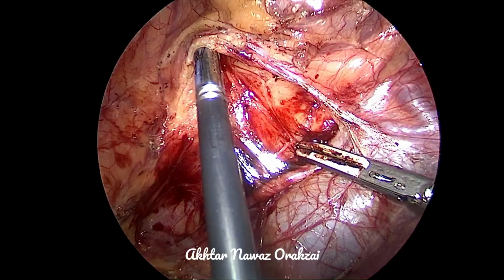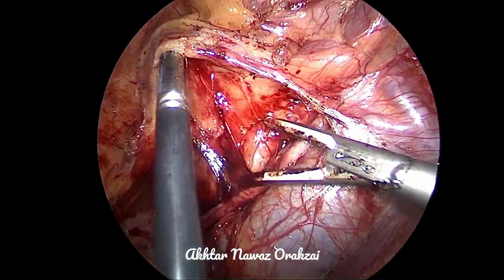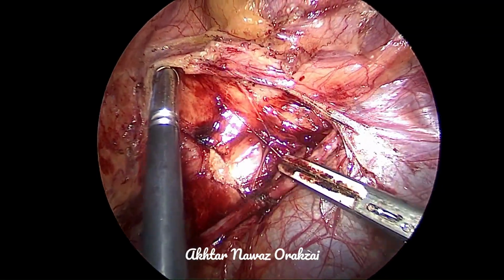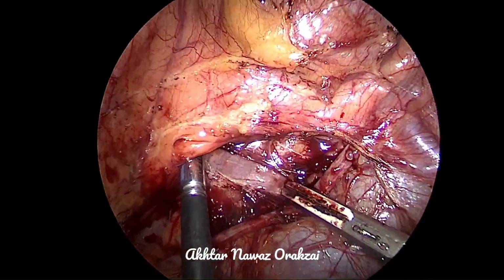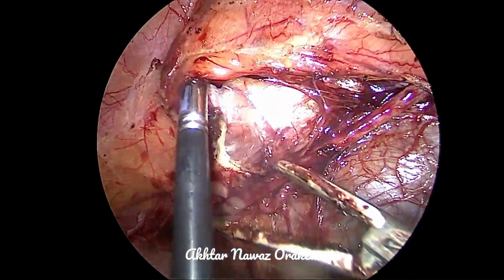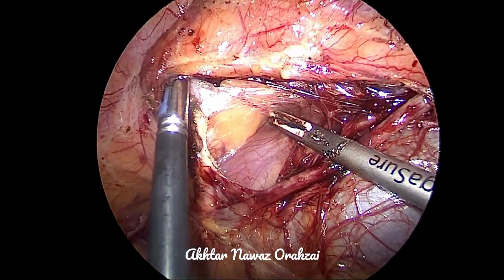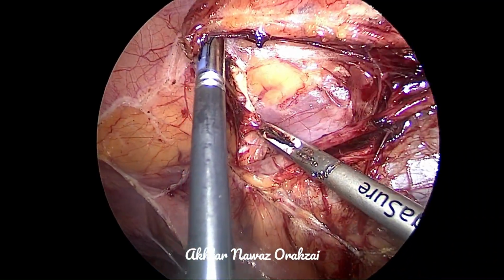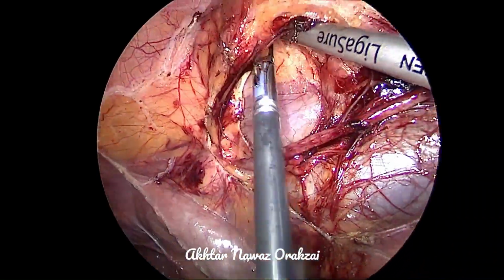We are performing a right-sided radical nephrectomy for a lower polar tumor in a young 26-year-old female. I have already mobilized the colon, and now I have created the window between the gonadal vein and the ureter.